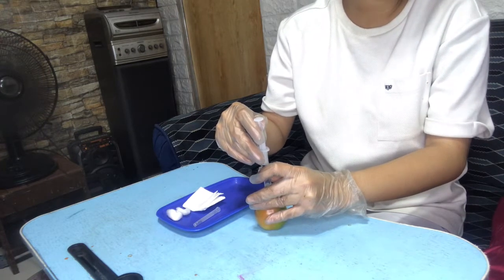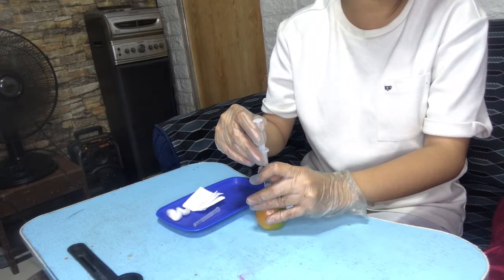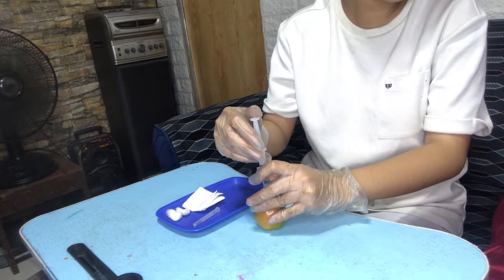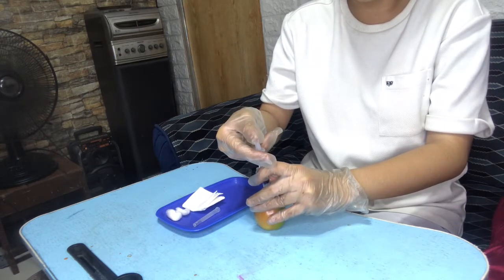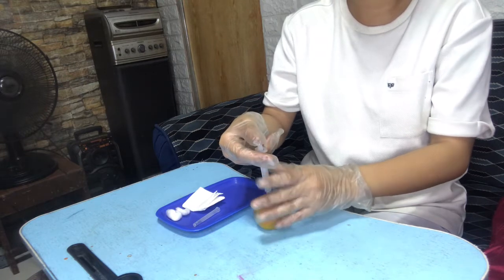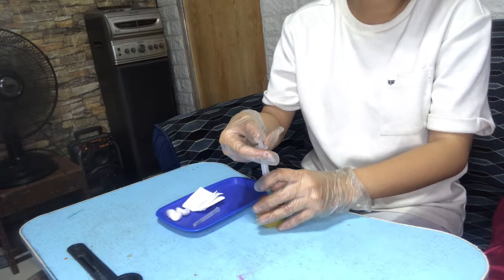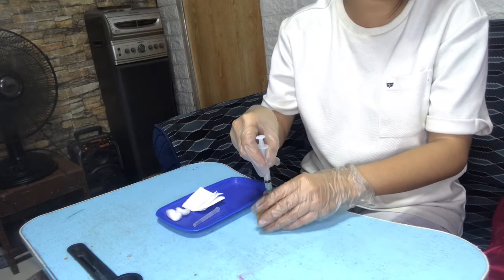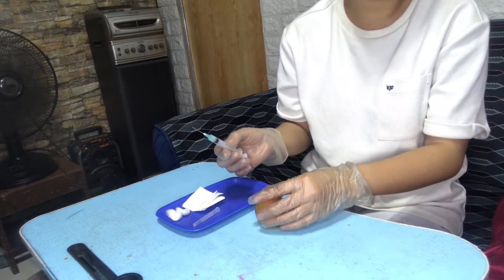Next, if blood does not appear, inject the medication steadily and slowly, approximately 10 seconds, while holding the syringe steady. So let's inject it. Next, after injection, wait 10 seconds. Withdraw the needle smoothly at the same angle of insertion.